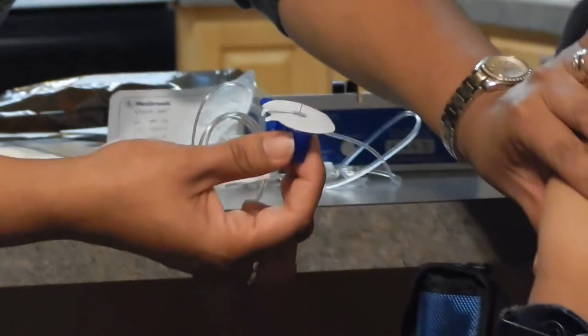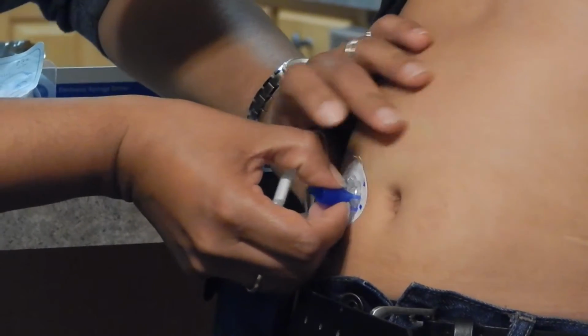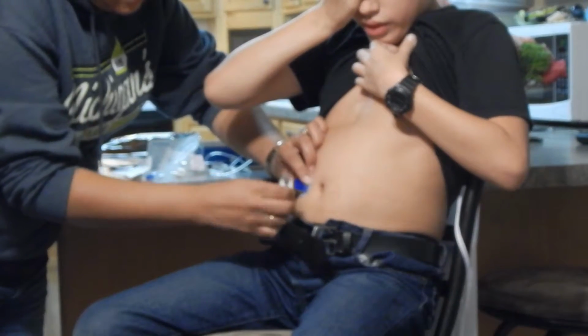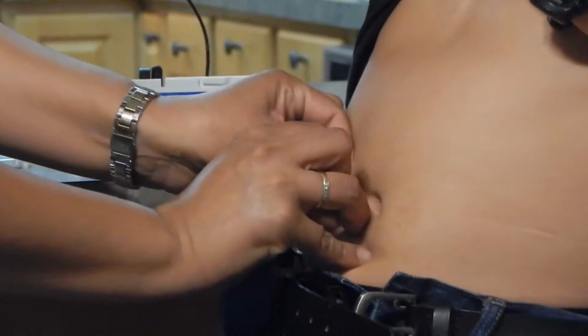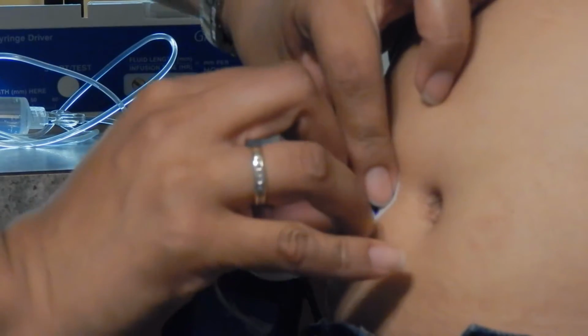I usually like to close my eyes so that I don't see it and it doesn't hurt. You squeeze the belly in this way. You grab the needle and stick it in there. Then you grab the part that you peel the sticker off. You take off that little white sticker, the one we were talking about earlier, that you had to peel a little bit so that it wouldn't be as sticky. And then that blue thing at the top, you take it out, because that takes out the needle. Then you push the blue thing against that needle, and so we get it all in. Now it's all in, and all that's in my stomach is a plastic thing.